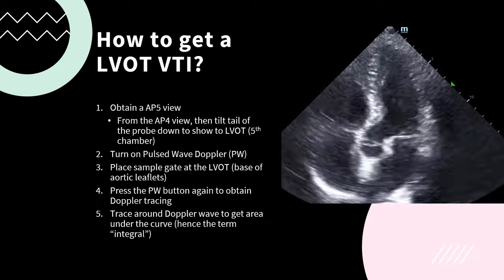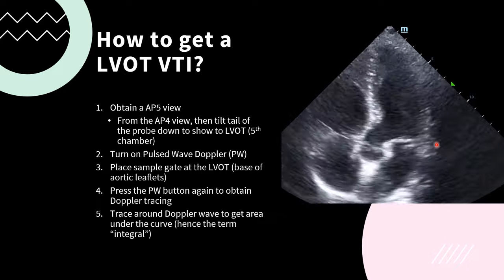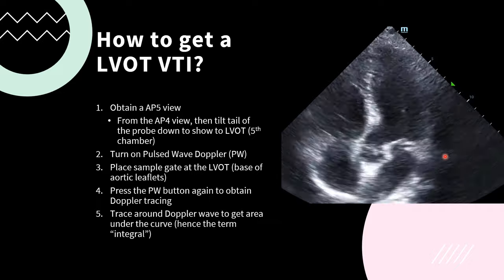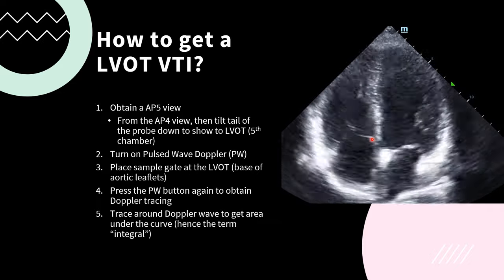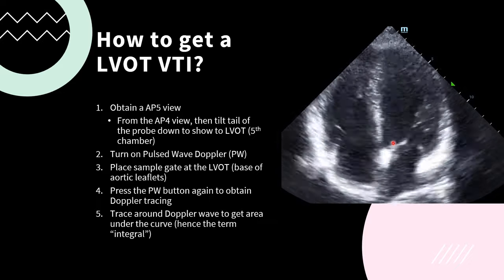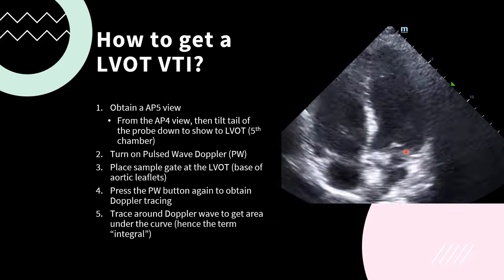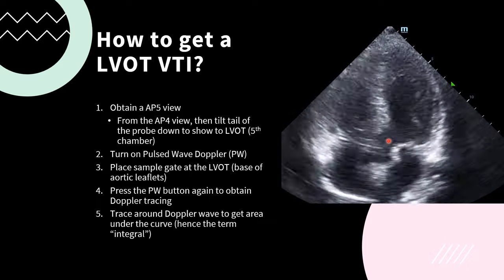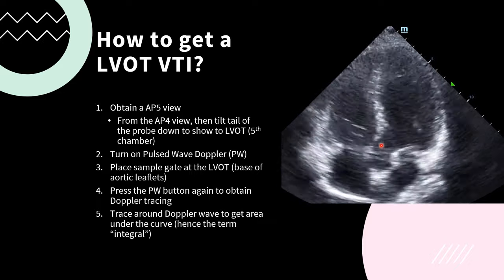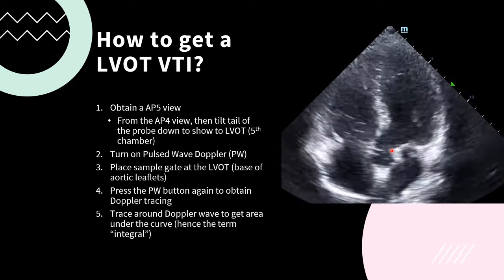To obtain an LVOT VTI, we need an apical 5-chamber view. We start with an apical 4-chamber view, then tilt the tail of the probe down to display the LVOT — seen here as the 5th chamber. We activate the pulse wave Doppler and place the sample gate in the LVOT right at the base of the aortic leaflets, then press the pulse wave Doppler button again to obtain a Doppler tracing. Ideally, the pulse wave Doppler beam should be in a direct line with LVOT blood flow, or as close to parallel as possible. Then we trace around the Doppler wave to get the area under the curve — hence the term "integral" in the acronym.